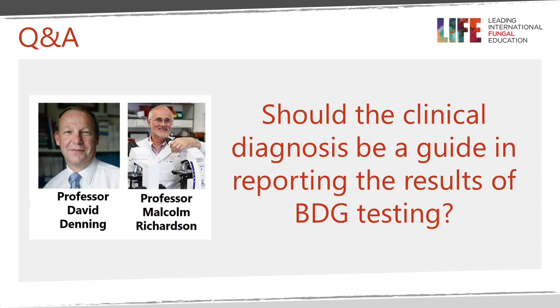So here's an interesting question. I'm sure lots of labs agonize over this particular issue. What would be your advice for lab personnel in reporting results of suspected invasive fungal infection when using this test? Should the clinical diagnosis be a guide in our reporting? That's an interesting question. I think a dialogue with the clinician is a good idea. I think that's always a good idea when you're dealing with an invasive fungal infection, because most clinicians don't feel comfortable with the whole management of these patients.